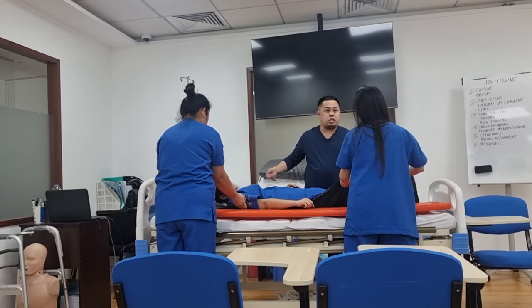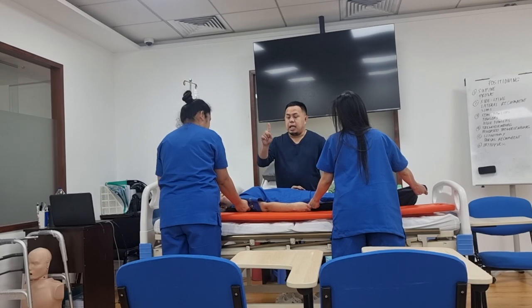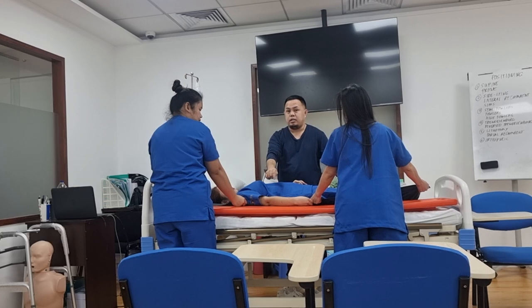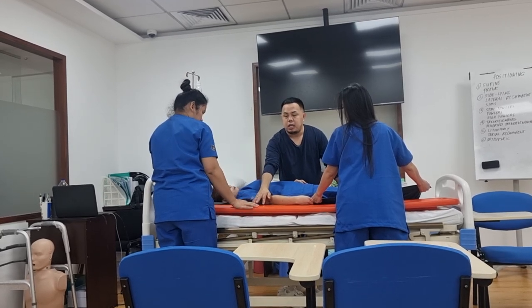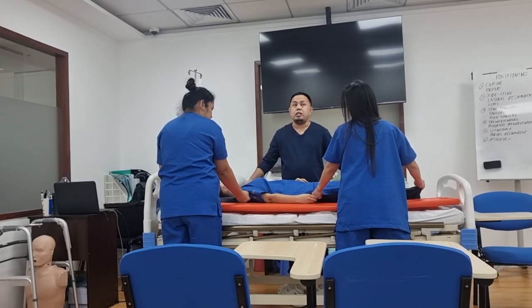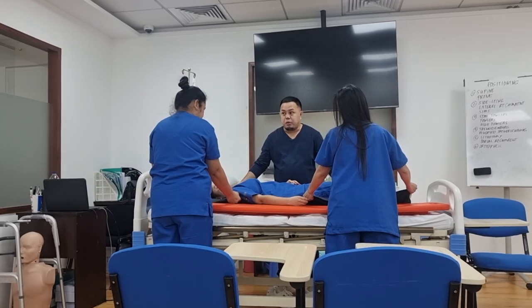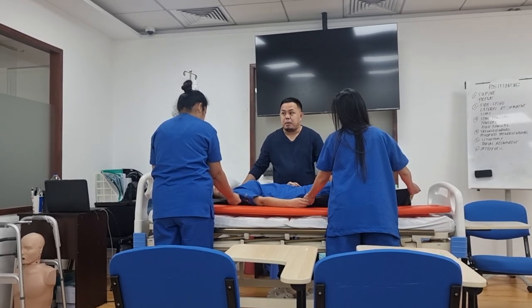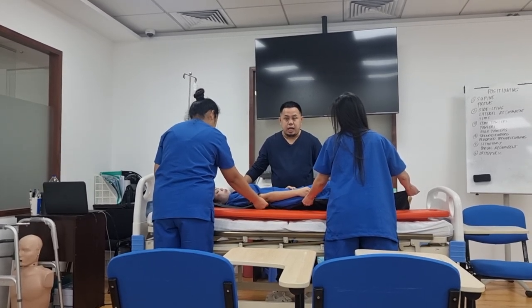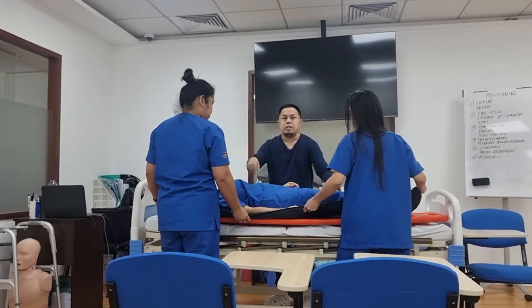Tell your colleague: 'Please hold the sheet — we will slide, do not lift.' The board shown on the video is the thin type, not this thick one — this is an emergency transfer board; they bought the wrong one. But on the video you will see how it looks. We slide the patient from the bed to the stretcher using the slider sheet. Count to three — one, two, three — and she's now on the board.